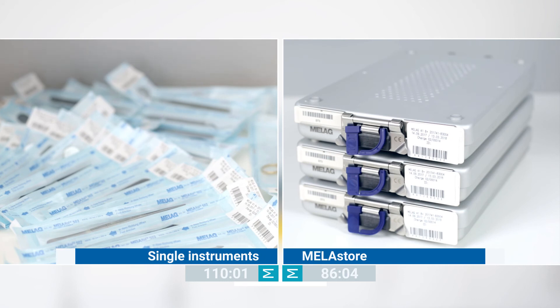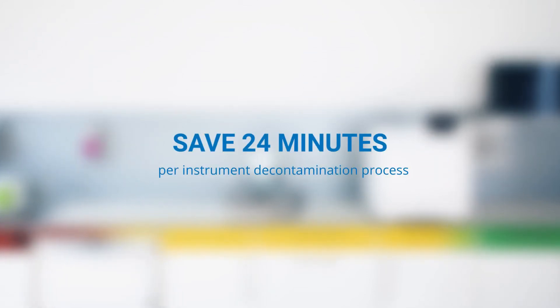The whole instrument decontamination process, from the cleaning and disinfection through packaging, sterilisation to clearance, will be improved. The MELAstore system saves around 24 minutes per process.